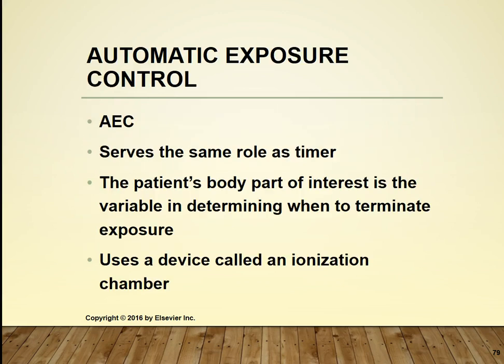Now, serving the same role as a timer is something called automatic exposure control. You will hear from here on out that it's just called AEC. So your AEC device operates a little differently from the others because it uses the patient's body part as the variable in determining when to terminate the exposure. So when we talked about the electronic timer, that's what this is about.